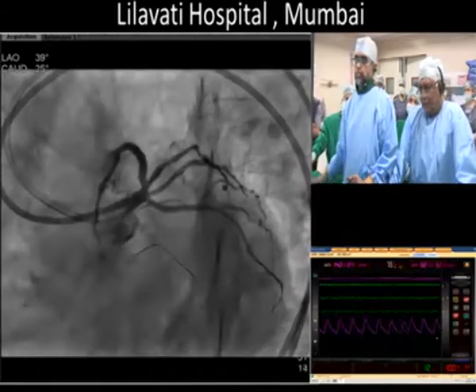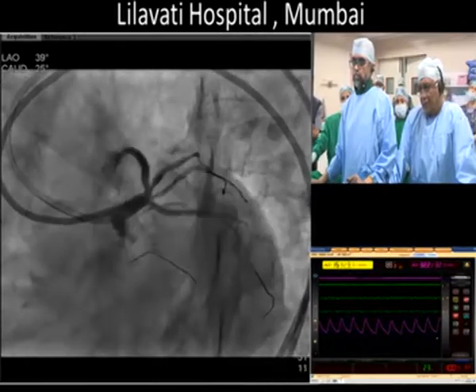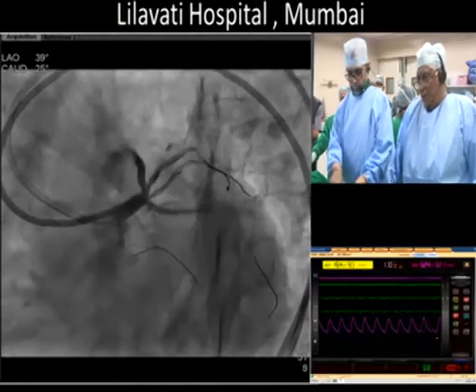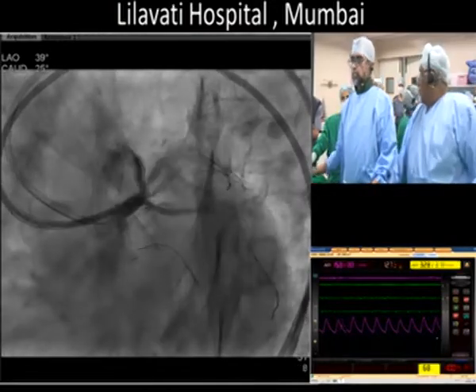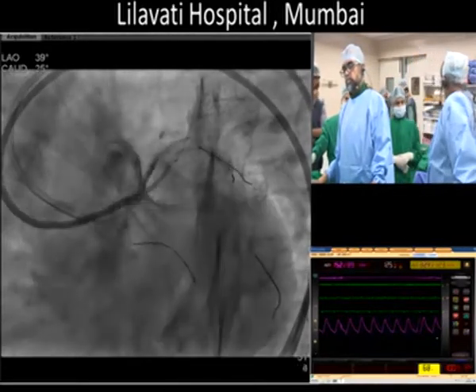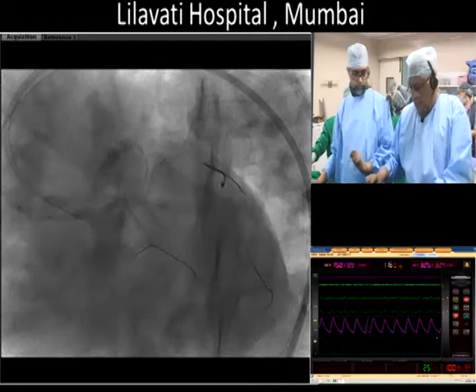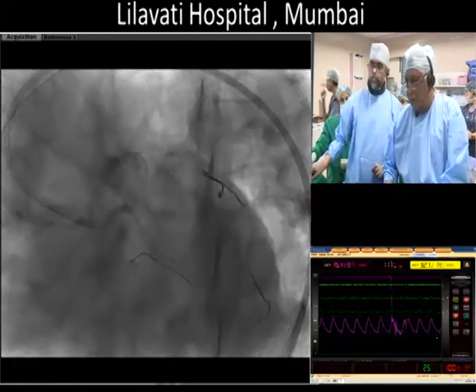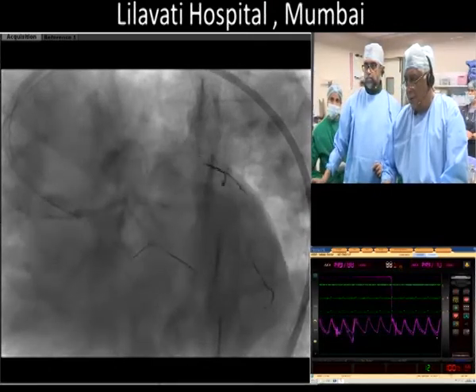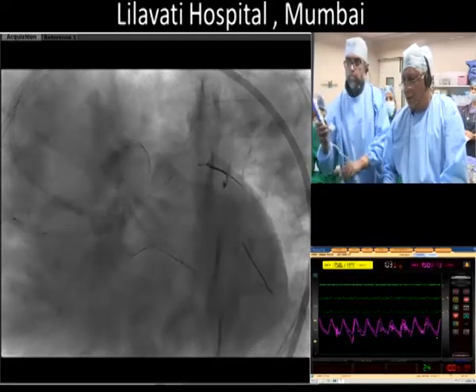So Dr. Mathew, you might have your wish of stenting the ramus now. But yeah, there is some compromise. Give me a 2.12 or 2.30. Okay, Dr. Mathew, this is looking, I'm in awe. I love it. This is looking good. You have about 2-3 minutes of transmission time. Yeah, give me one extra minute. Oh, you got it.